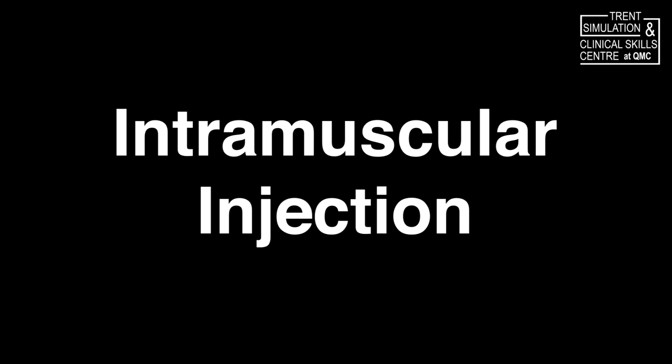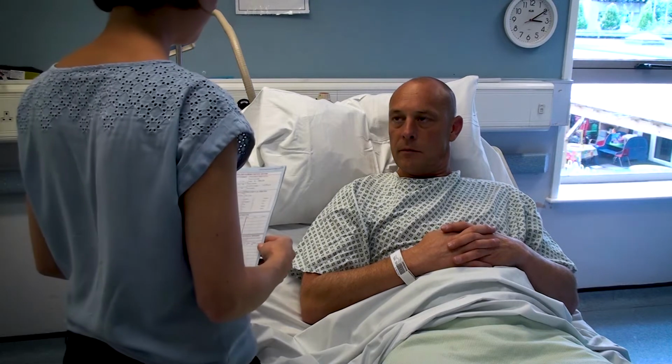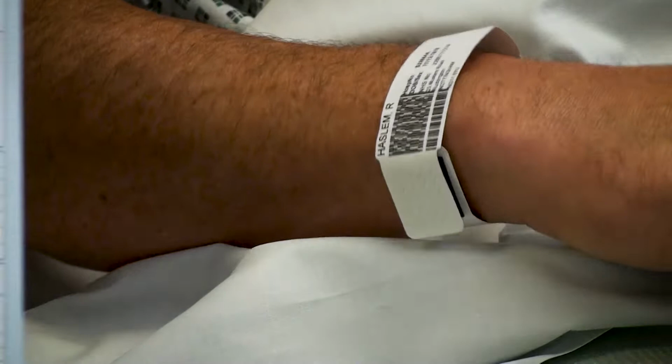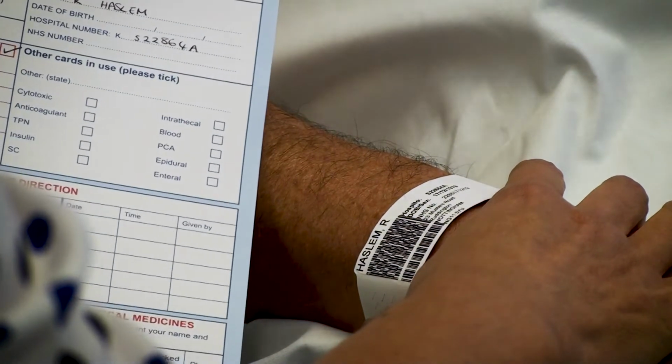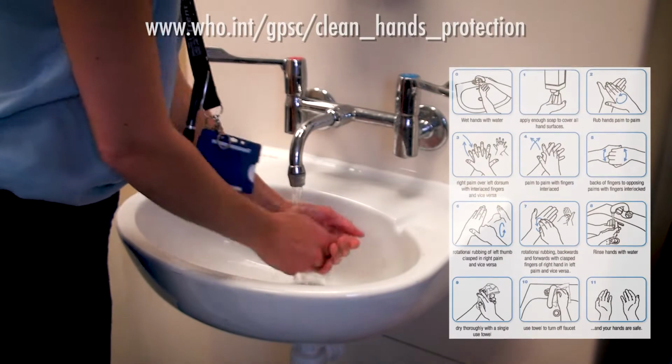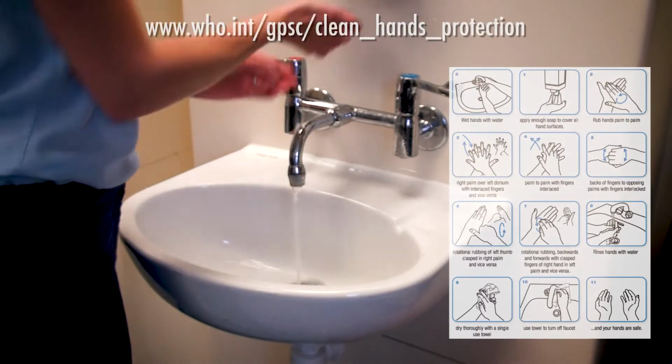Welcome to the clinical skills video for the intramuscular injection. Prior to performing this procedure, you must ensure that you have explained to the patient what you are about to deliver and that you have confirmed the patient's identity. Also inquire about any history of adverse reactions or allergies. You must then wash your hands thoroughly using the 11-stage approach.